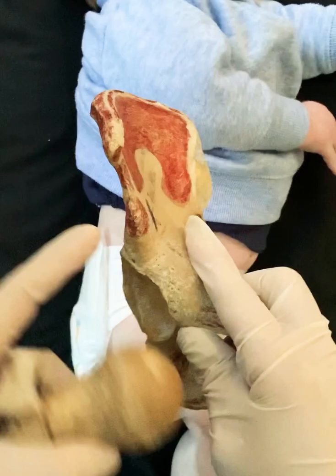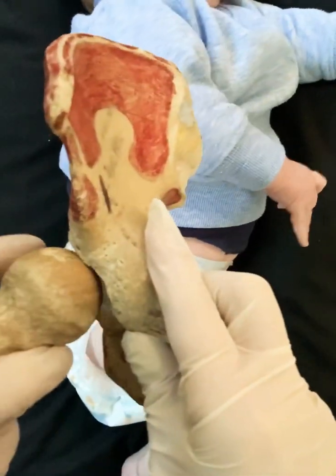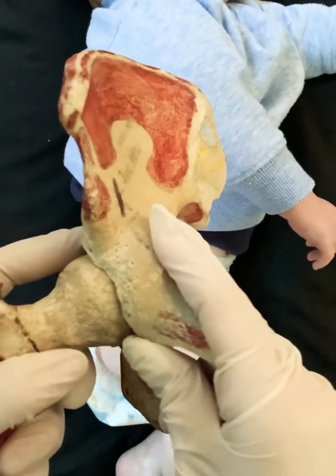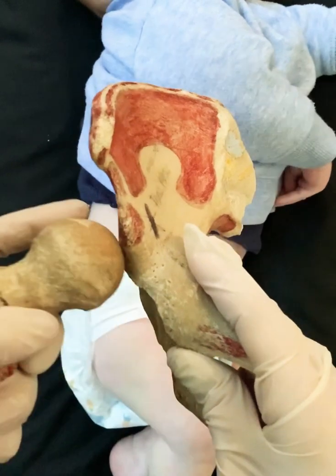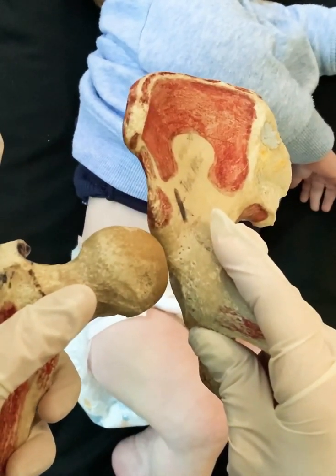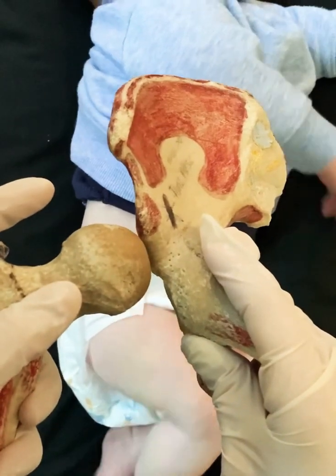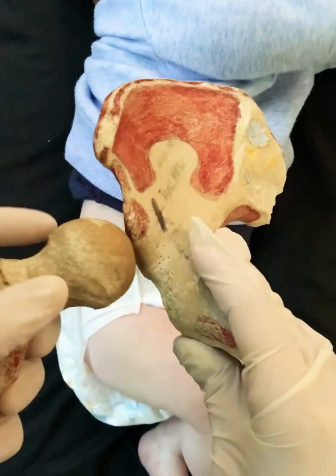A hip that has been rolling in and out can cause a second depression on the ileum — a pseudo-acetabulum. We need to be careful: in a dislocated hip, if there's a depression here and you take your lateral ultrasound, it can look like the hip is sitting in a socket when in fact it's sitting in a false socket caused by a long-term dysplastic hip.